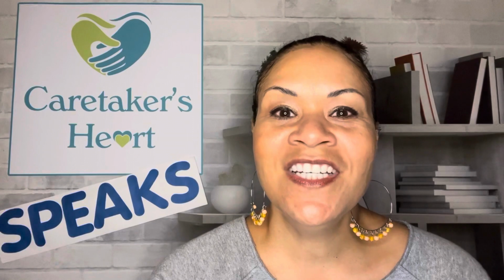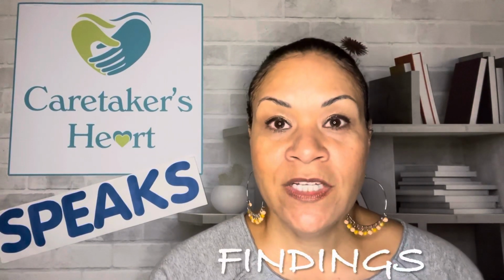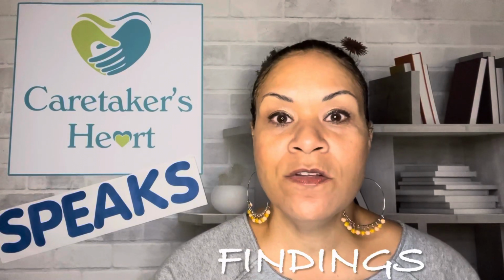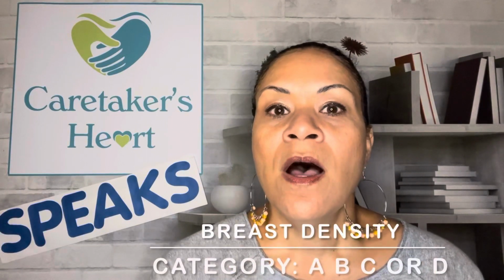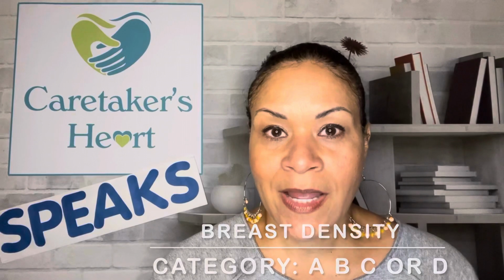The next section is the findings section. And this section is really important because it details what the radiologist actually saw on your mammogram films. And usually this is detailed as right and left side, and the radiologist will be specific on what was found in each side of the breast. There is also a description of what type of breast density you may have.